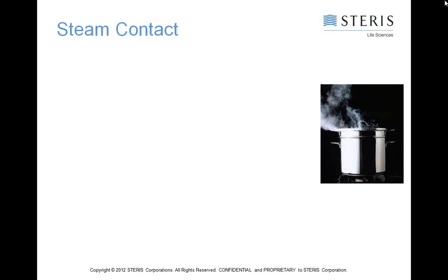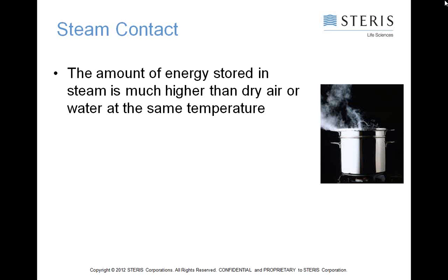Beyond the time and temperature, the next important thing is once you have those established, that's good. But what we need is for that steam to make contact with the load. The amount of energy stored in steam is much higher than dry air or even water at the same temperature.